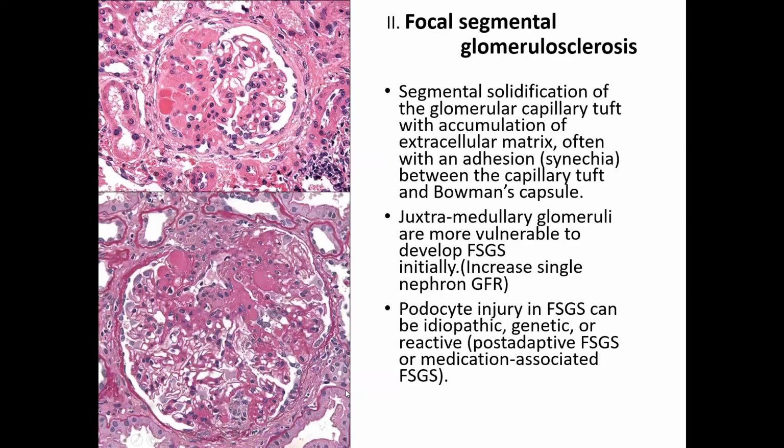So coming to the next morphology, focal segmental glomerulosclerosis. What do you mean by focal segmental glomerulosclerosis? The name itself is telling. Focal means that less than 50% of the glomeruli are involved, so the remaining may be normal. Focal in a real biopsy means less than 50%.